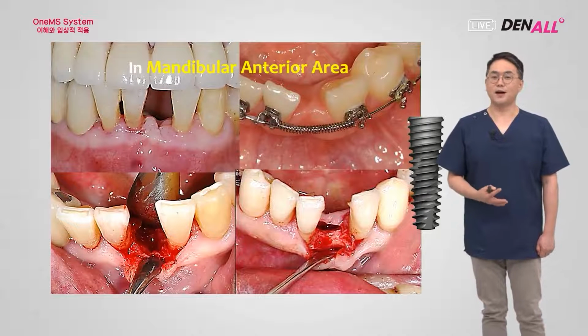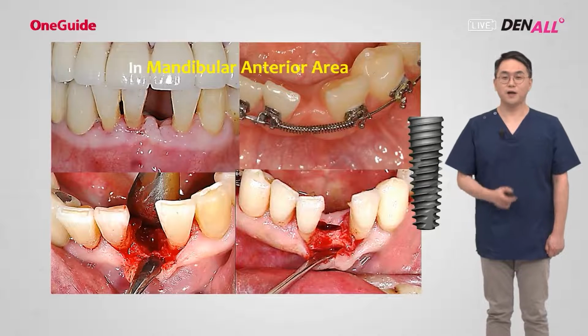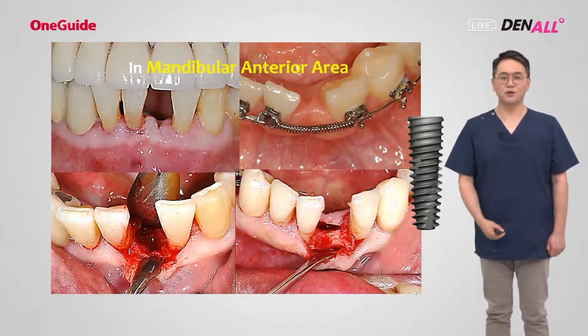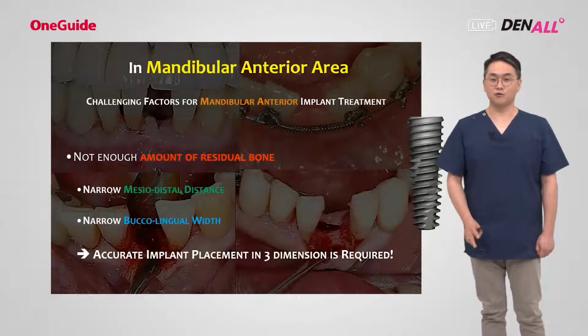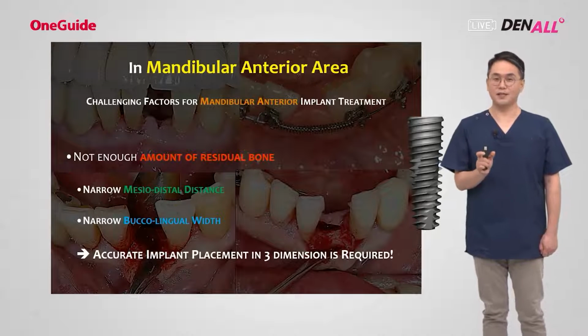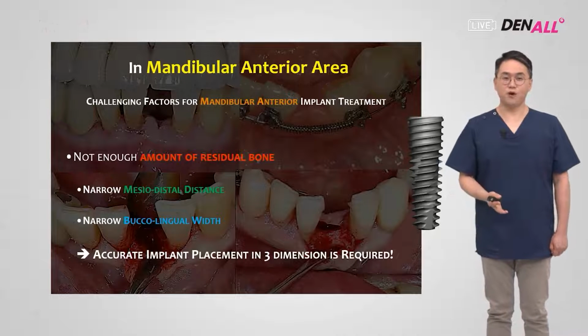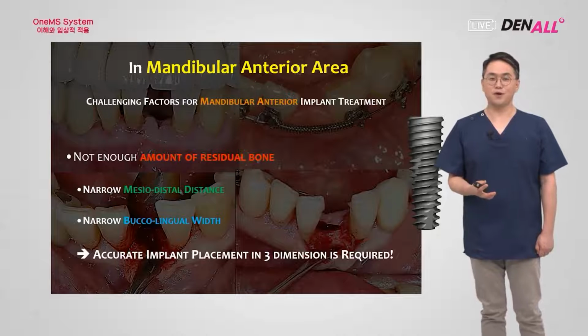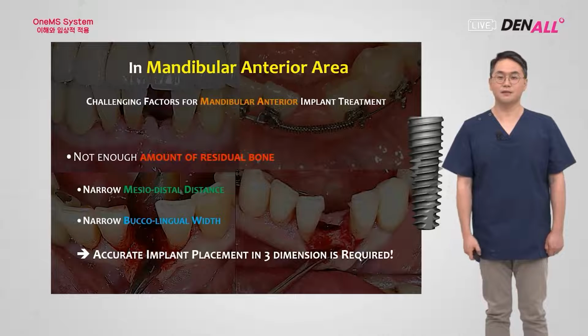Now, on the upper anterior part, I showed you how the OneGuide system can be used. The lower anterior part is also a challenging area to place implants. There are a lot of issues. The biggest issues would be, first, a narrow bone width, and secondly, a narrow mesiodistal distance. In other words, it's tricky to drill and to place the implant. The bone is thin, so you need to do grafting.